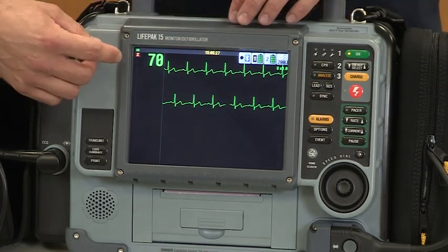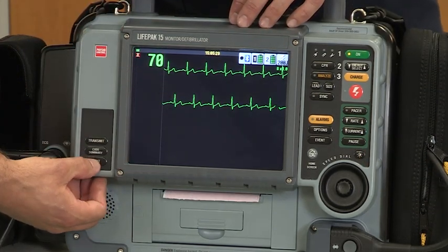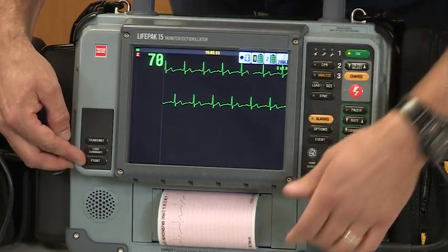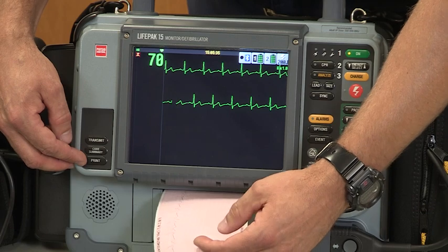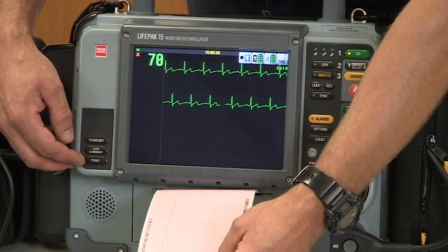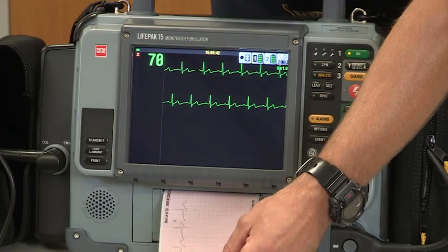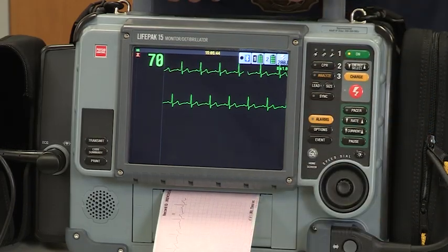To print a strip, if you see something that catches your eye and you want to take a better look at it, simply press the print button, located in the same spot as on our LIFEPAK 12s. Print whatever you think you need to look at to analyze rhythm. Just push print again, and it will stop printing.